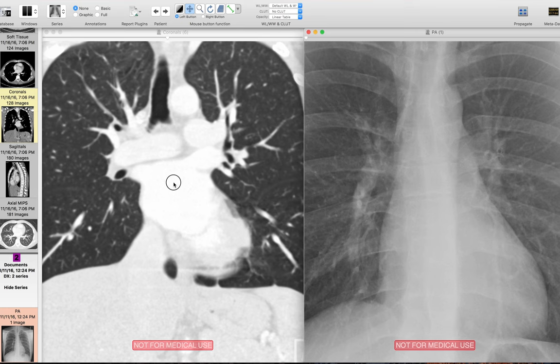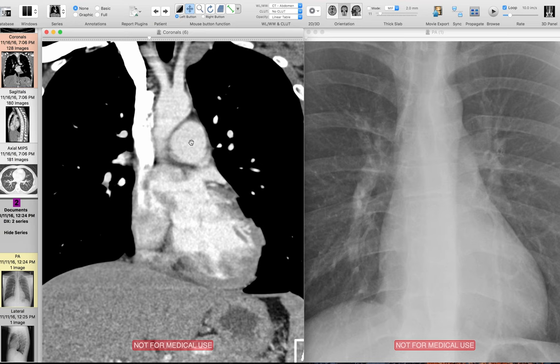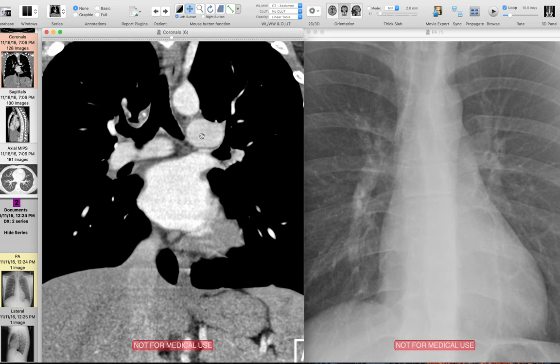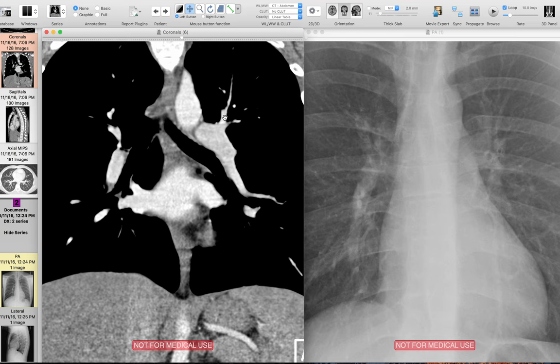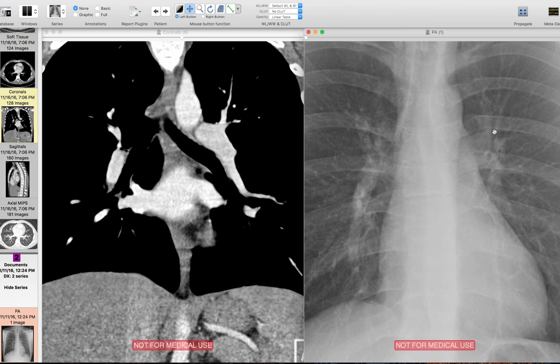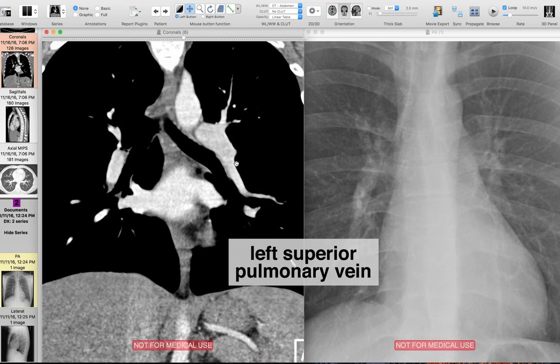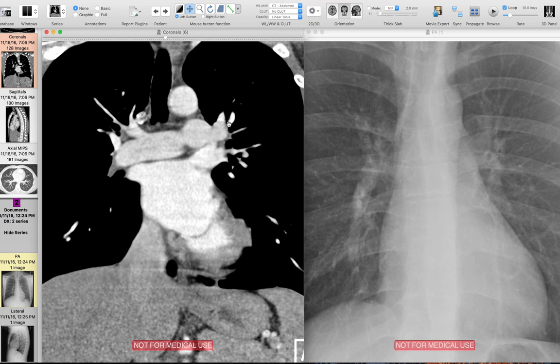On the corresponding CT in mediastinal windows: this is the main pulmonary artery bifurcating into the right and left pulmonary arteries. The left pulmonary artery continues forward into the interlobar pulmonary artery, with the part going up being the apical branch of the pulmonary artery. There's another vessel located just lateral to this apical branch — that is part of the superior pulmonary vein, specifically the left superior pulmonary vein, located just lateral to the apical branch of the pulmonary artery.